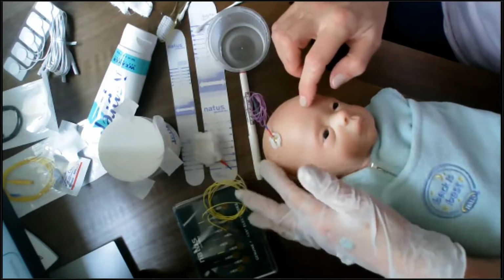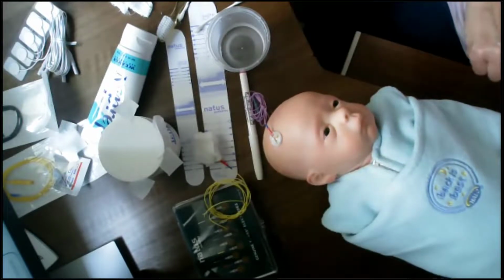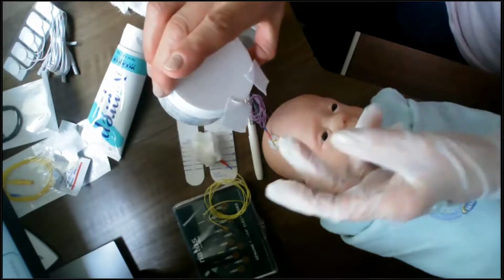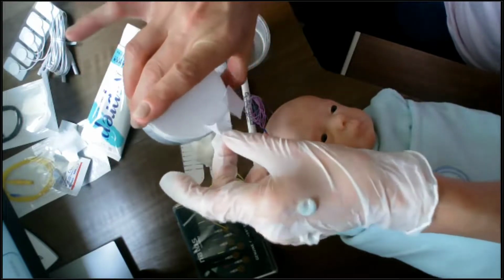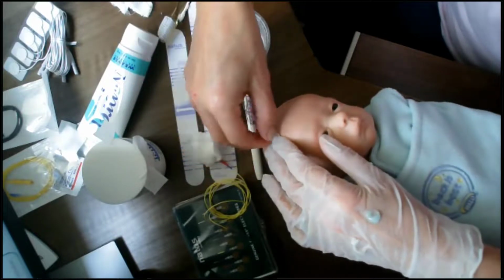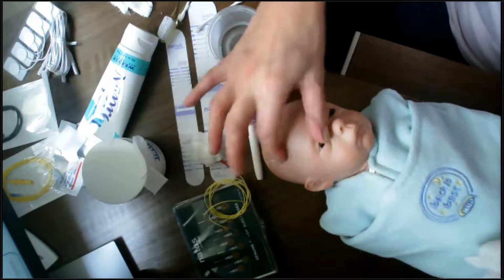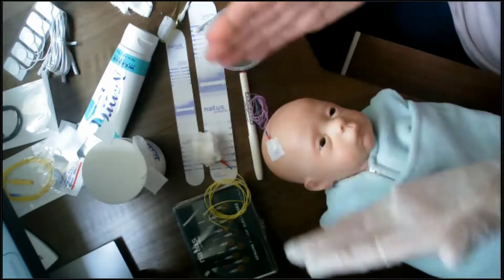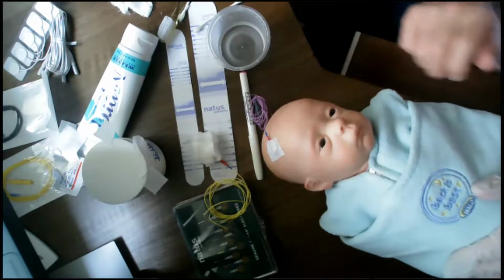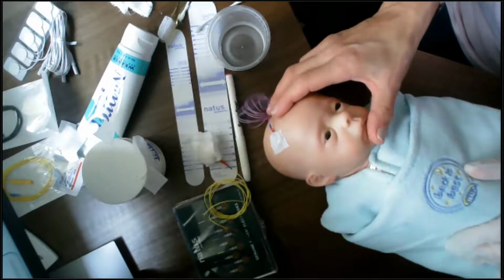Okay, and I often just then take some of that paste and use it to secure that electrode a little bit more in place. Then remember I said I'd already prepared my tape. It's sitting on the outside of my pot. I take my piece of tape and place it over the top of the cup electrode. Remember, you could use skin tack or skin prep on the hair to mat it down if you needed to. But you can see that my electrode is very nicely positioned in place there.